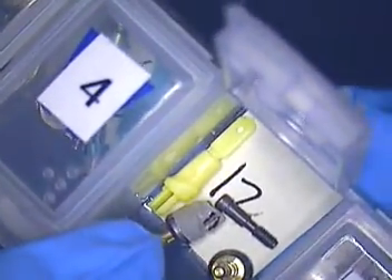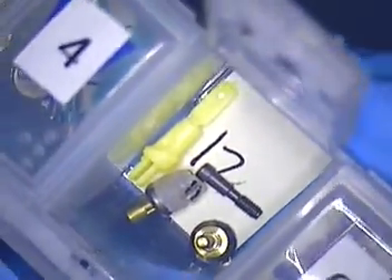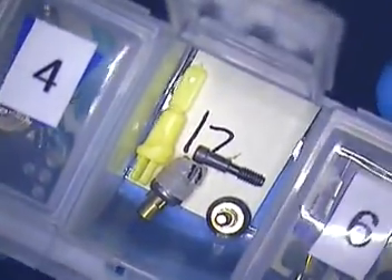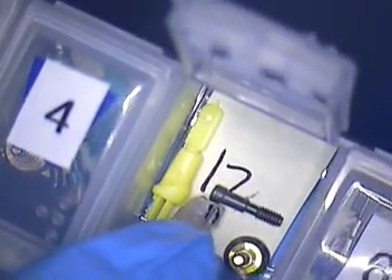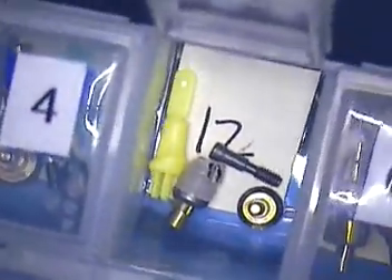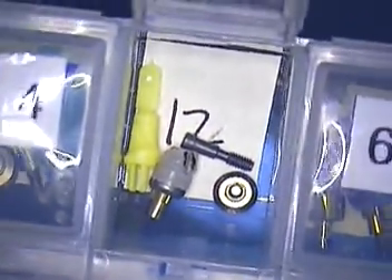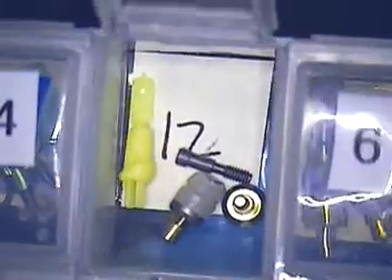These were PEEK abutments, I believe, that I used to make a bite registration abutment. So that would go in the model — and not only in the model, but it was already in the mouth to take the bite registration. I've covered that technique with Ken's case in the past, which is another implant case. You can look at that.